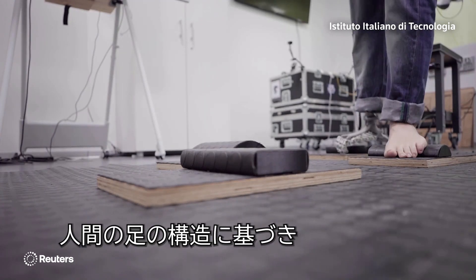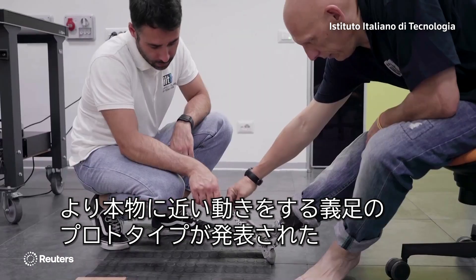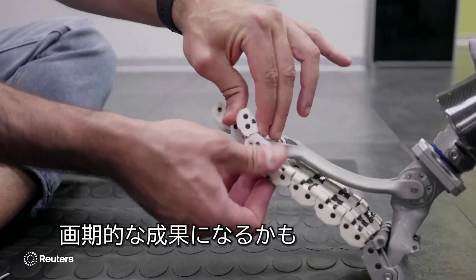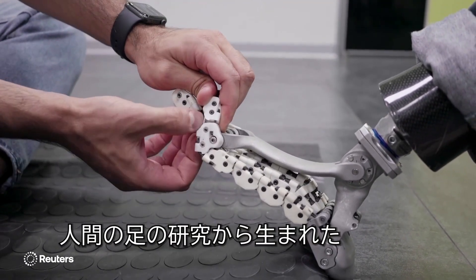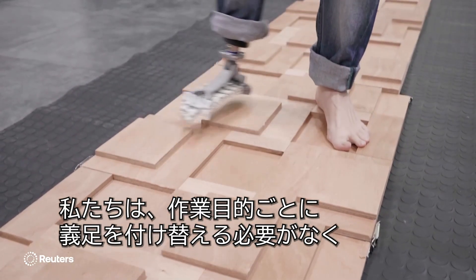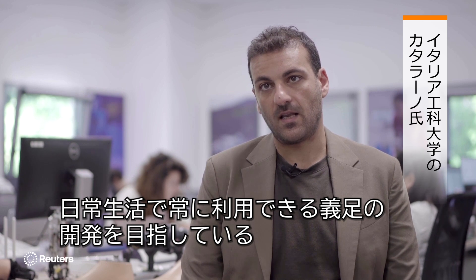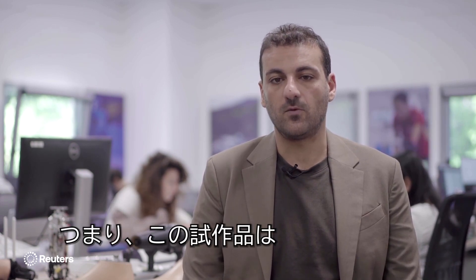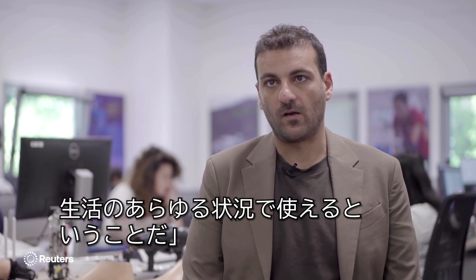This prototype prosthetic foot is designed to simulate the anatomy of a real human foot. Researchers think it could be a game changer for people with limb loss, and possibly for future humanoid robots. The idea of the SoftFoot Pro, born from the study of the human feet, is to have a system that users can adopt every day in their life without changing the feet for specific tasks — meaning it can be used in every condition of daily life.